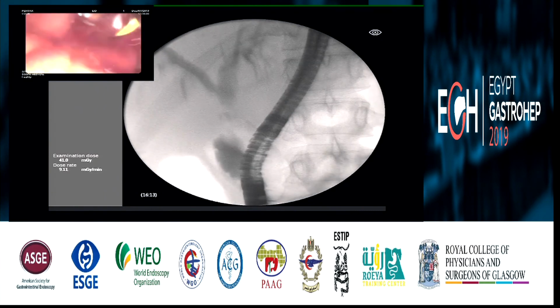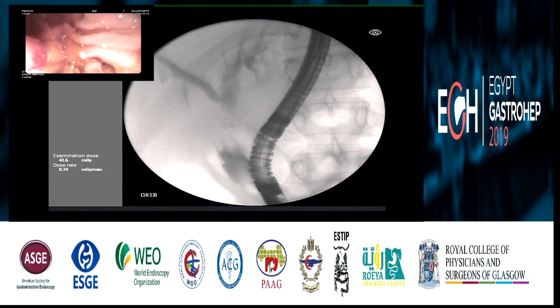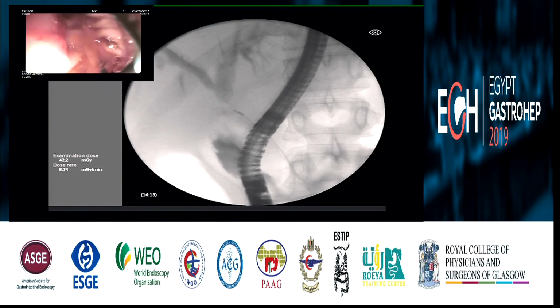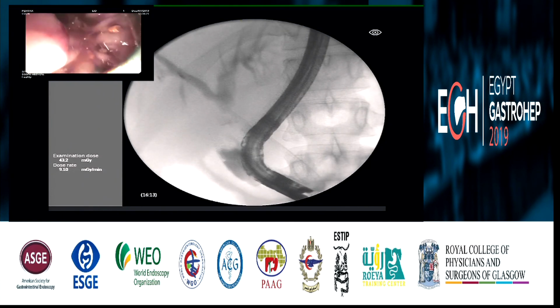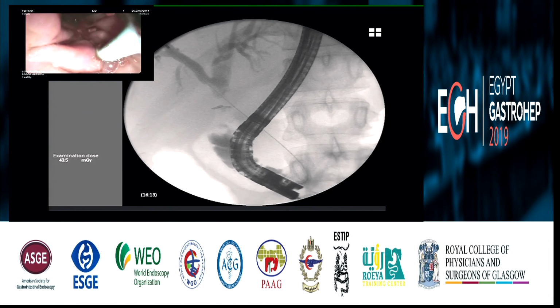It's a valid option. One of the concerns for such a very tight stricture, which barely allowed the passage of the guide wire, is to put two stents, one at least 8.5 French probably, and then the other one 10 French. Passing the second through such a tight stricture is going to be very difficult, in my opinion.